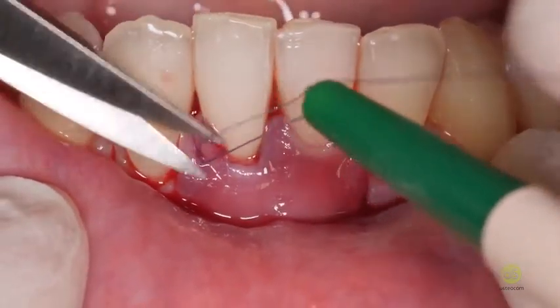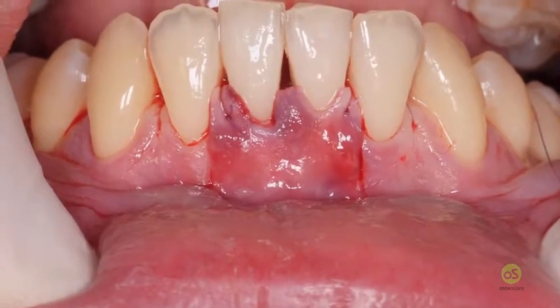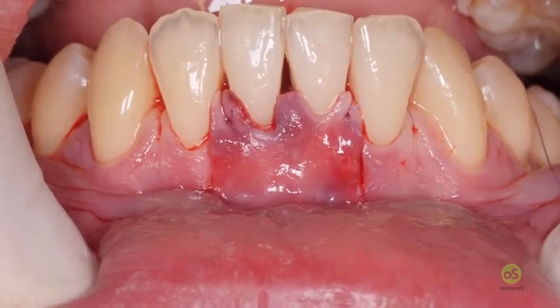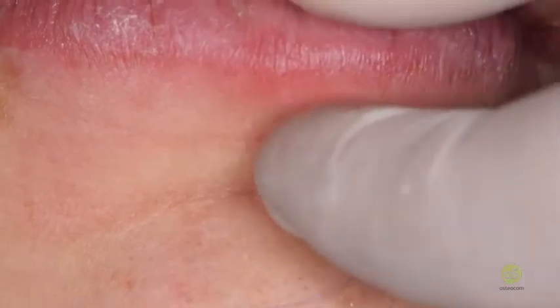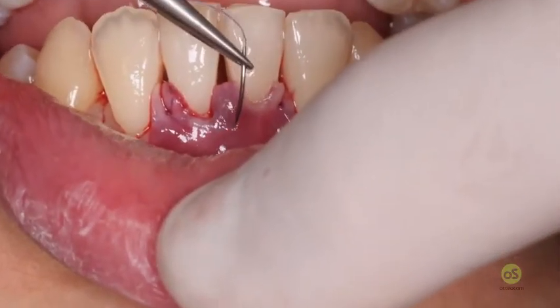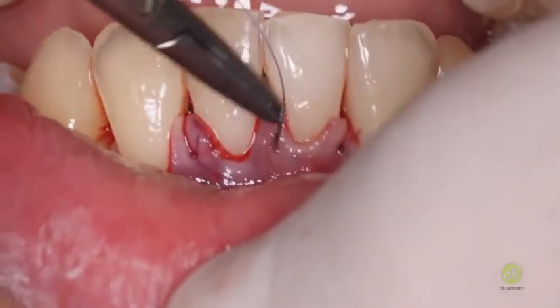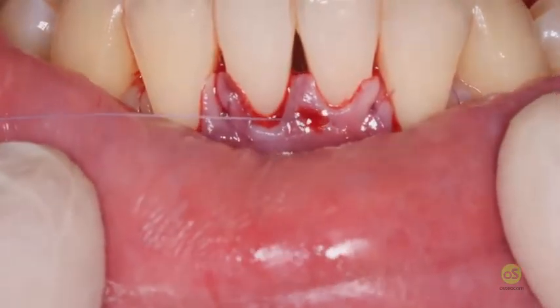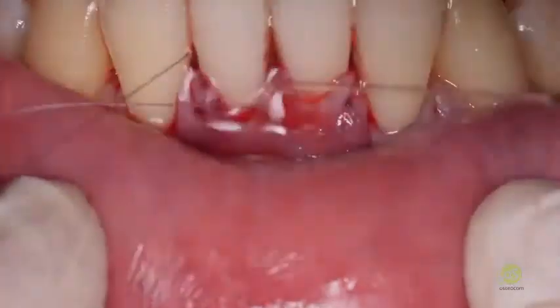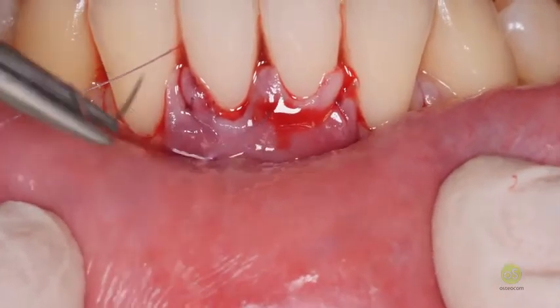So now it's time to attach my flap. It's vertical, the only tissue to which I can attach my flap, and this tissue is the periosteum. So I just suture also the interincisor papilla in the final position, and then this suture will be removed. So surgical, lingual aspect, take anchorage in one of the two papillae, selecting the biggest one to place the papilla in the final position.